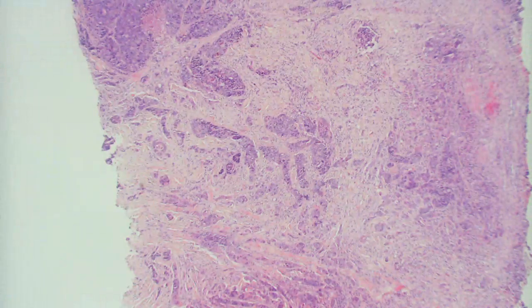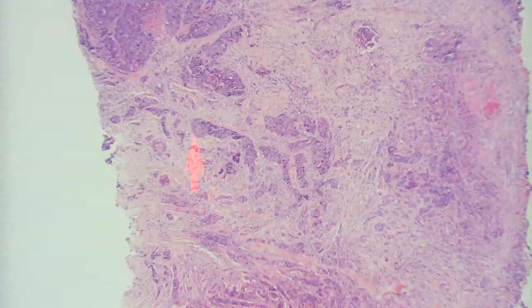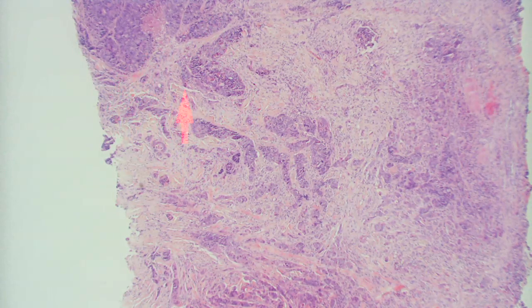I think malignant kind of has varying zones of color change, and you got all these different shapes going on. Yeah, you got this sort of diffuse pattern in the dermis of, I guess people say cords and tubules or something. So maybe. Yeah, kind of cords, ducts, strands, little aggregations of cells. Good, excellent. So now, is that sort of characteristic of a primary or possibly a secondary cutaneous involvement?